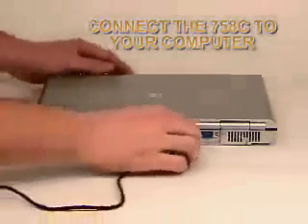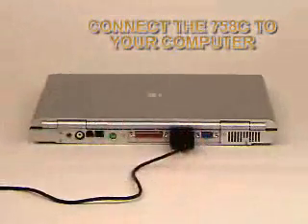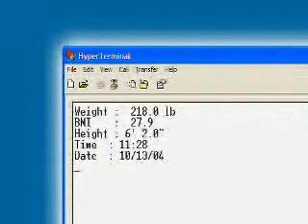Connect the 758C to a computer using the serial port and you now have efficient electronic medical record keeping, useful in physicians' offices, weight loss clinics, or athletics. By pushing the print enter key, the weight data is sent to the PC and can be automatically inserted into a patient's medical records with the push of a button. This gives you the option of having weight, BMI, height, time, and date inserted electronically into your medical records simply by pushing one key.